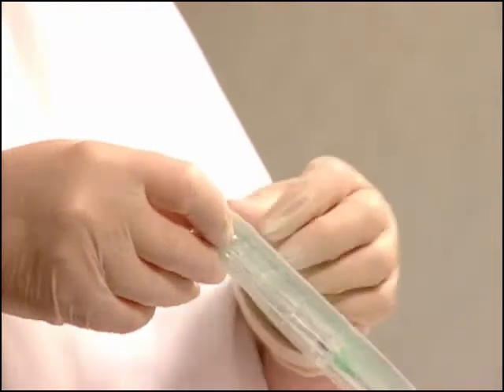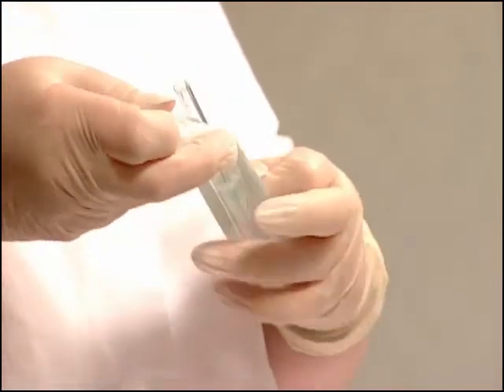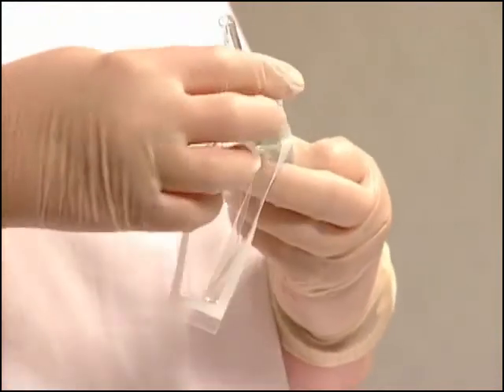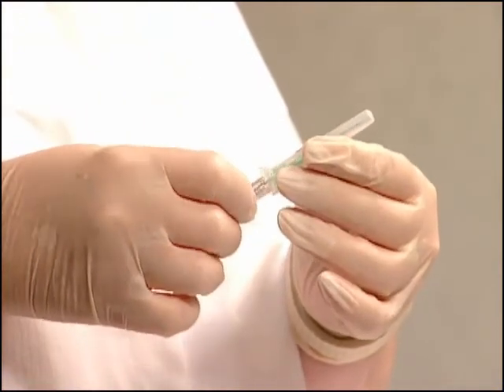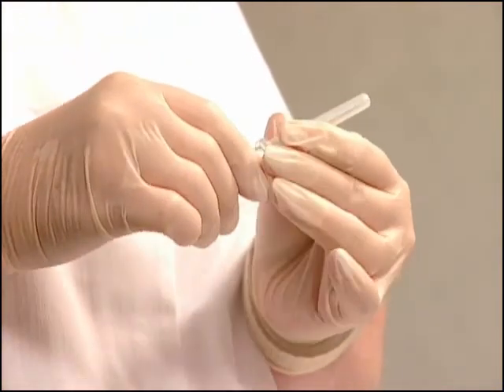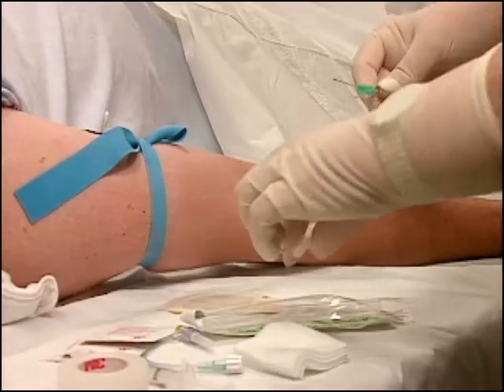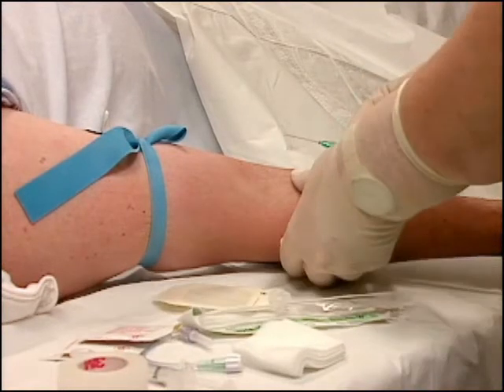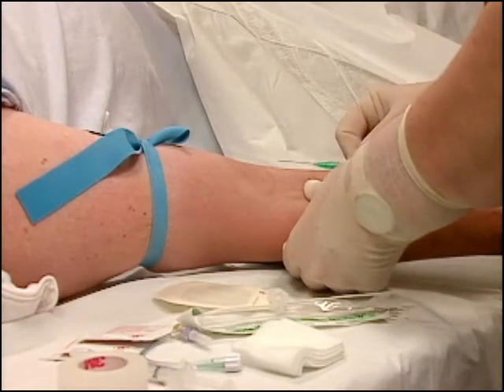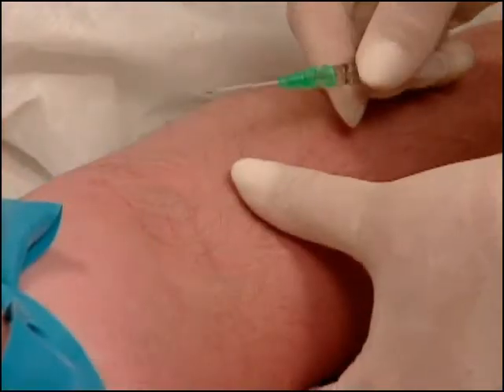Open the film covering the catheter and remove it from the package. Work the plastic top off of the catheter, taking care not to contaminate the needle itself. Take care not to slide the catheter back and forth over the needle, as this may cause damage to the catheter sheath. With your non-dominant hand, grasp the patient's arm or hand.